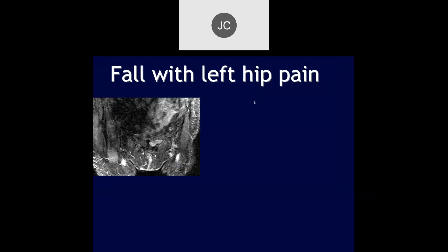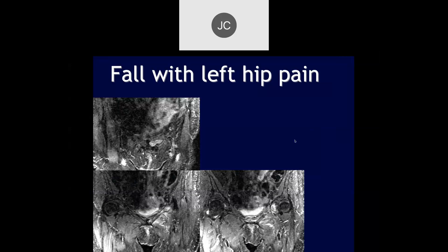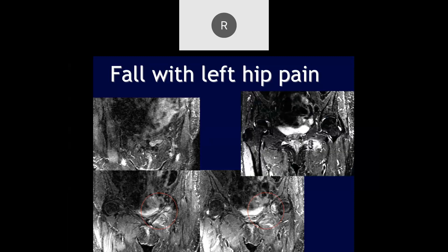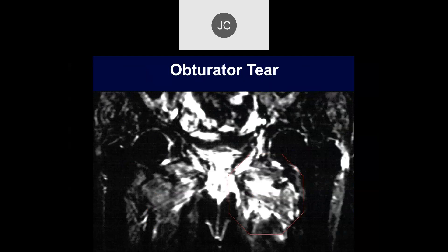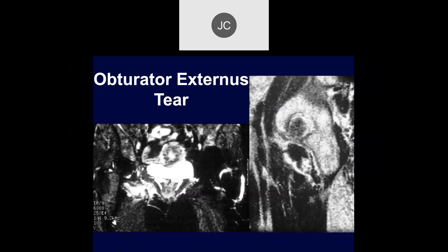We'll continue to talk about trauma involving the hip. This case is a fall with left hip pain. It looks like there's some edema in that left parasymphyseal pubic ramus area and the anterior acetabulum. On the coronal STIR sequence, there's edema in the adjacent musculature. With fractures of the pelvic rim, you can get hemorrhage into the adjacent soft tissue, but sometimes this could also be tears of the muscles. This is a blowup of that injury showing a fracture with an obturator externus tear.